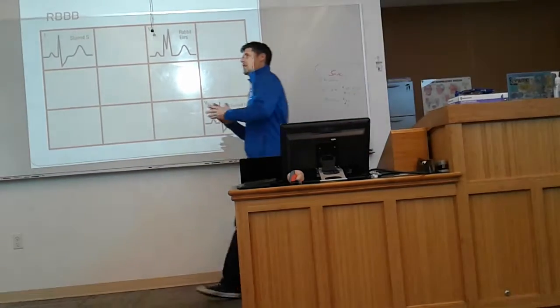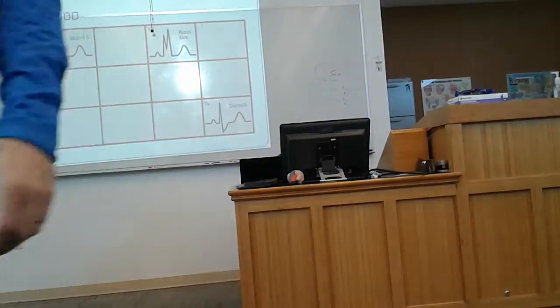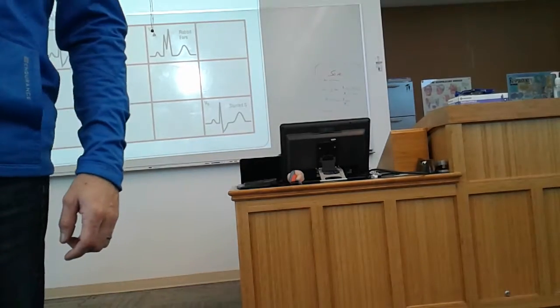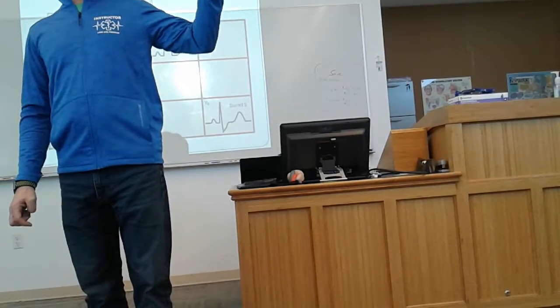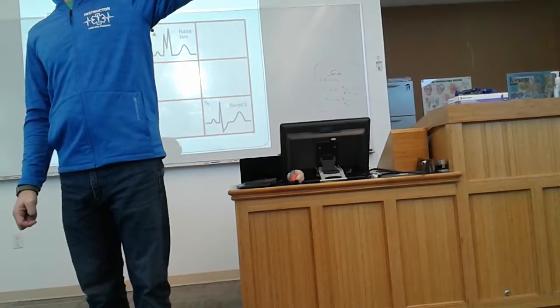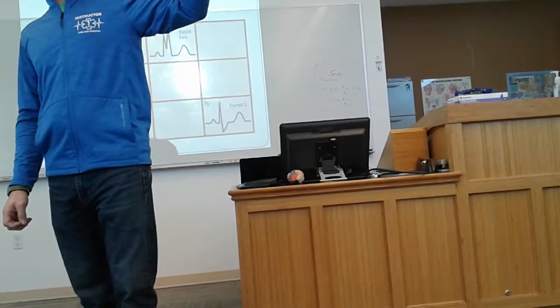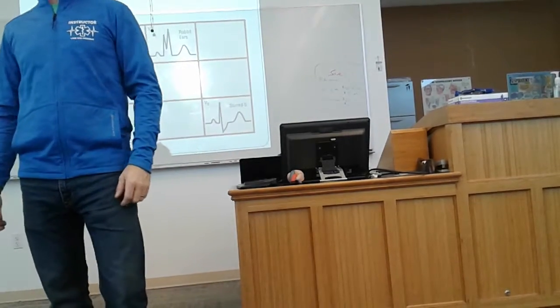Oh, hey, just because I think we might as well talk about it, AVF is really biphasic. Where's the axis of this heart if AVF is biphasic? 0 or 180, right? If we think that it's 0, going towards 0, then what should lead 1 be? Positive. How positive? Completely, the most positive. Wow. Oh my gosh, this stuff almost makes sense.